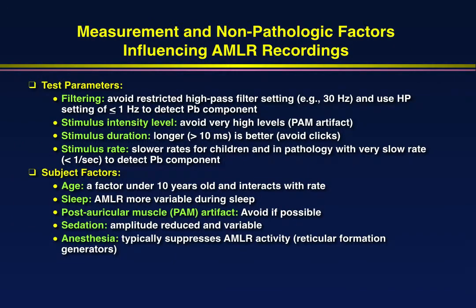In the interest of time, I won't read this slide, but let me tell you there are many factors that influence the middle latency, and that kind of gives some people some pause in whether they should even record it. But don't be discouraged. It does mature over time. It doesn't fully mature until age 10.